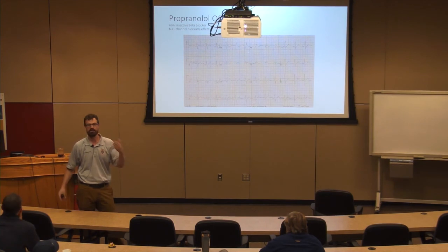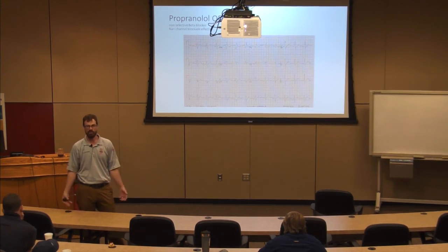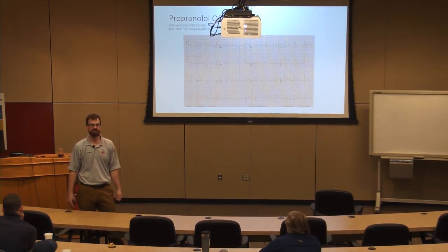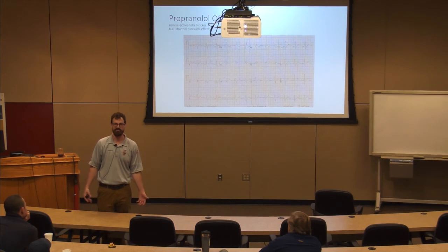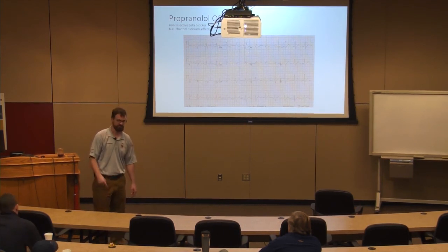But if you get somebody on Flexeril who's overdosed and you see a wide QRS, and you show up and they're sick as a dog and now they're in VTAC and seizing, and I say, why didn't you give sodium bicarb? And you say, because it wasn't a tricyclic, I'm not mad at you, I'm just disappointed. It'd be one of those things, right? I'm not mad, I'm just disappointed.